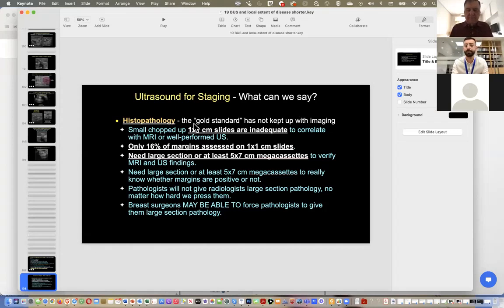Okay, you suggest that we do follow-up or do biopsy from the lymph node? No, I'm saying I would allow 6 to 8 weeks. I would do a repeat ultrasound of the axilla in 6 to 8 weeks. And if they're still enlarged at that time, then I would core biopsy them then. But I would give her a little bit of time because you can certainly get reactive lymph nodes to surgery. And especially if there's a big seroma, she might be more likely to have reactive lymph nodes. So I'd give her 6 to 8 weeks to see if they regress.